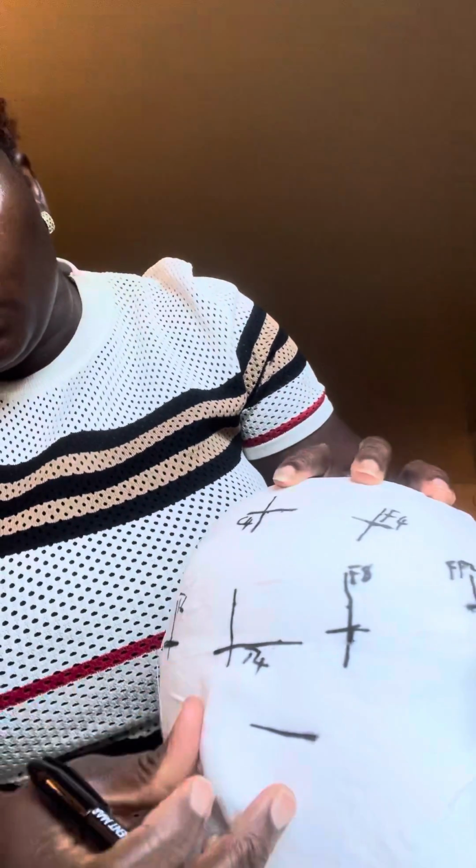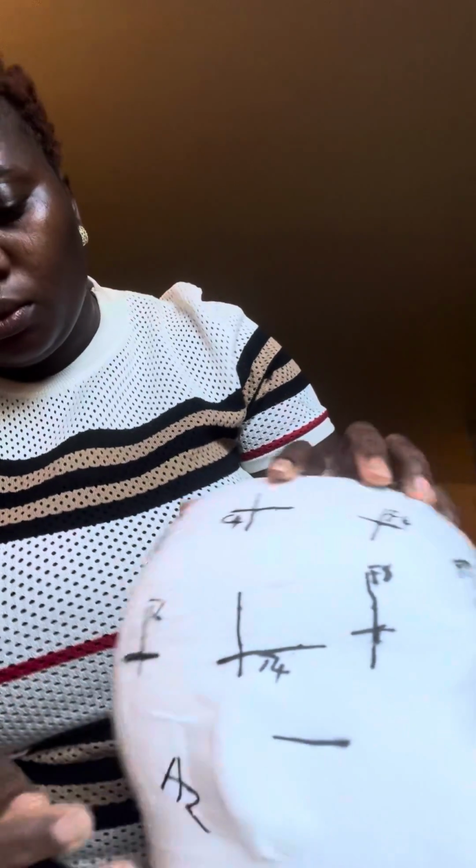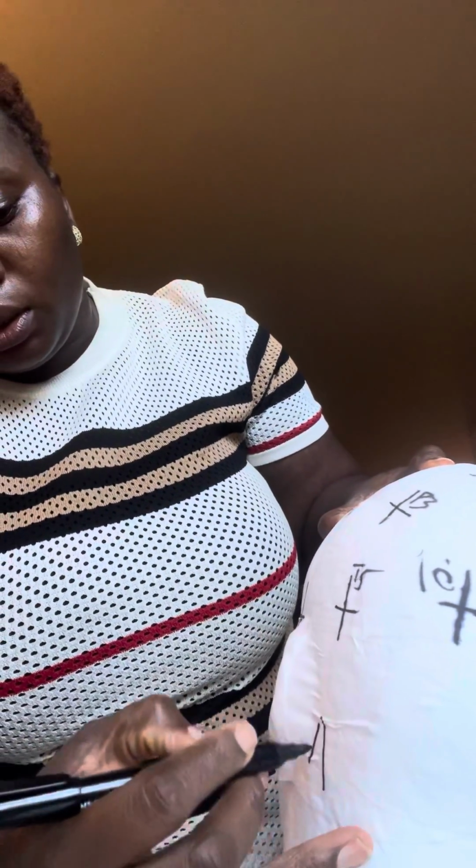So this is how I got my 10-20 measurements, and this is the mastoid, which is your A2, and this is A1, the mastoid. So I will go ahead and do my electrode placing.